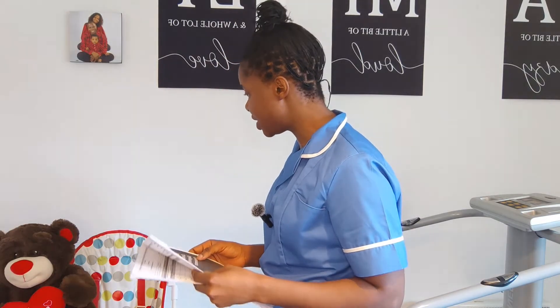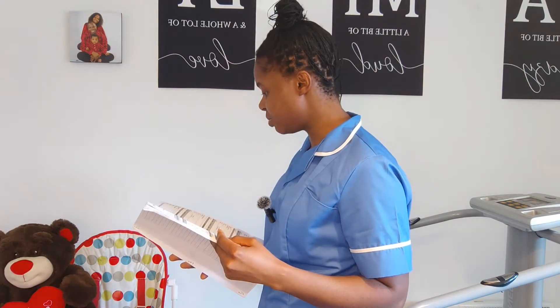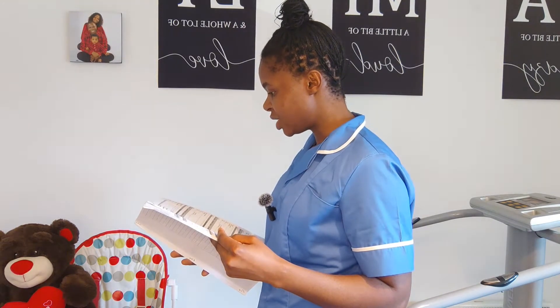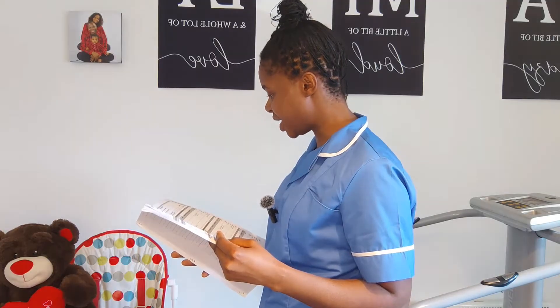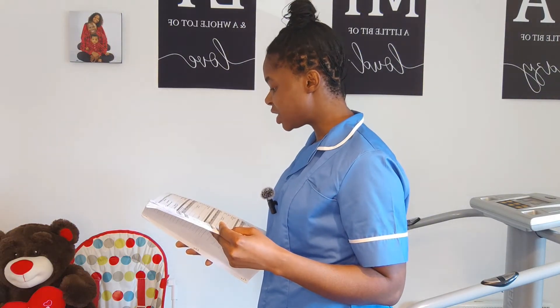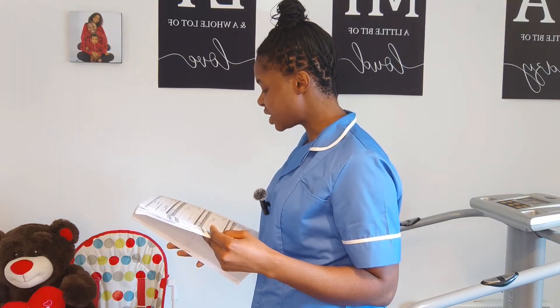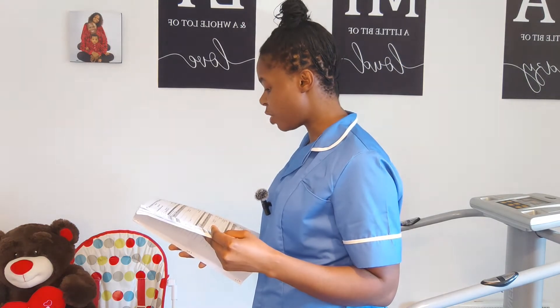Janet, is it okay to look at your medication record chart? I have here the medication record chart for Janet James, date of birth 01/01/1992, first line of address 27 Dotting Grove, Badley Green. Height: 1.5m, weight: 72kg, BMI not stated. The drug is insulin glargine, dated today, dose 14 international units, frequency daily, route subcutaneous, duration continuous, start date today, finish date not stated. The prescriber signature and bleep are properly documented.